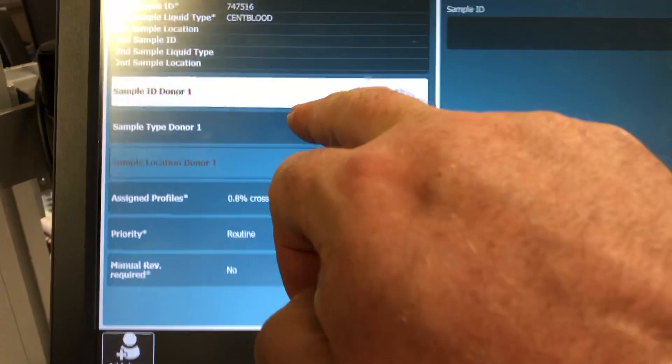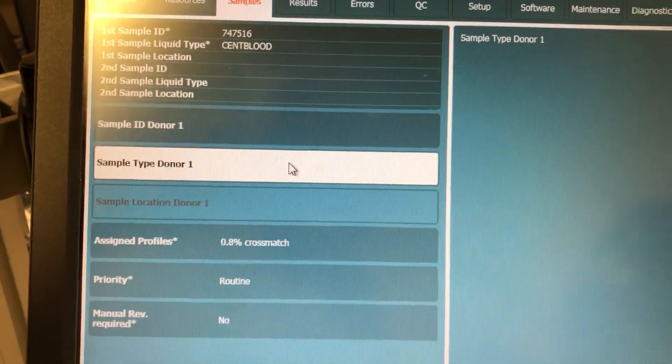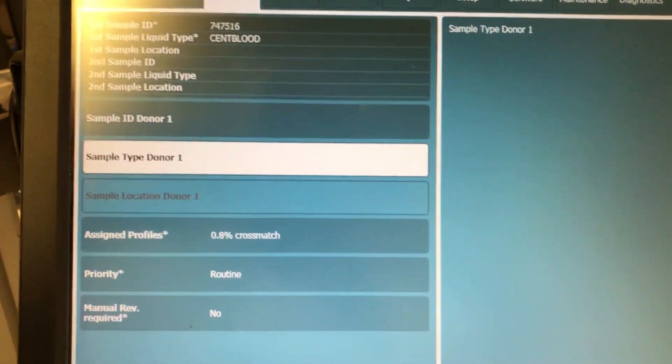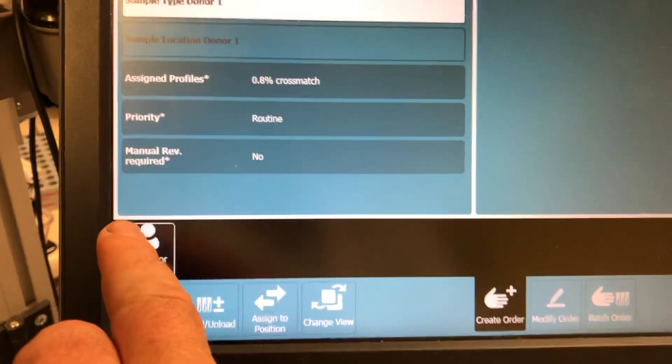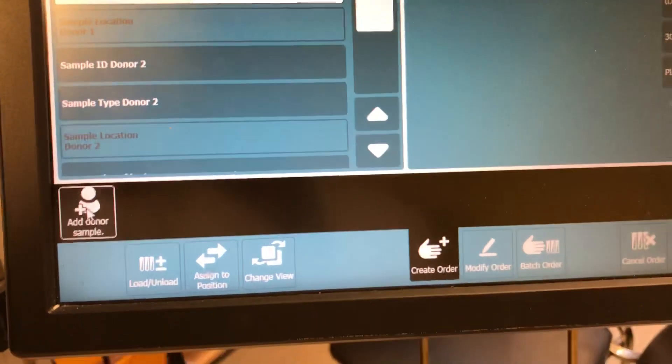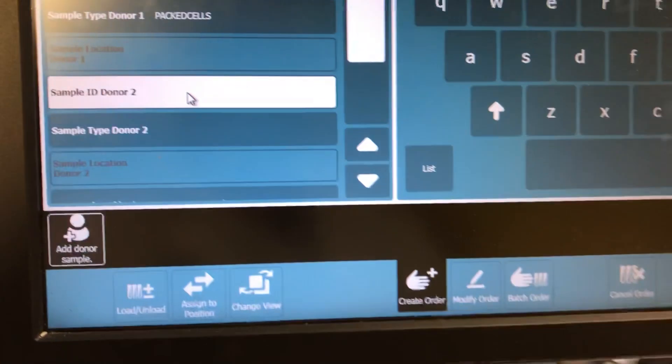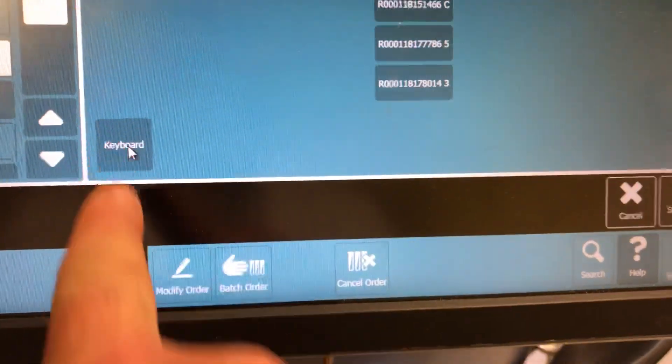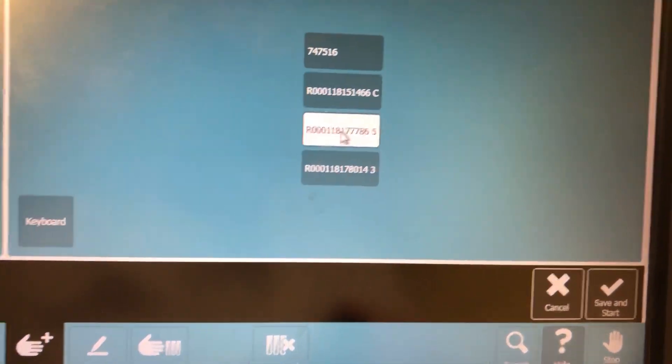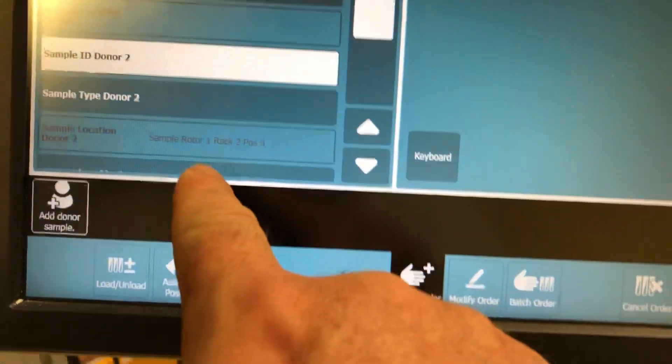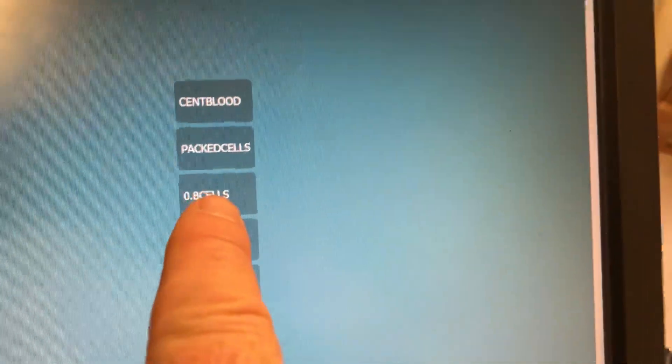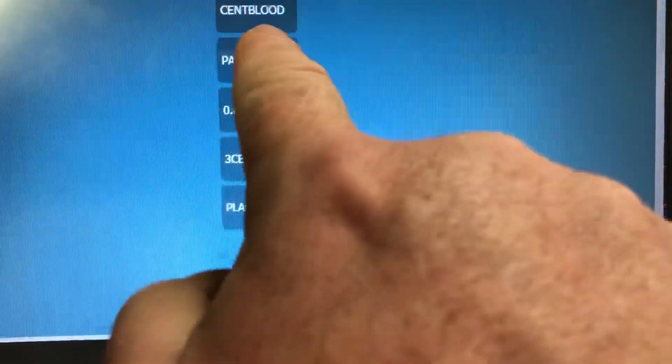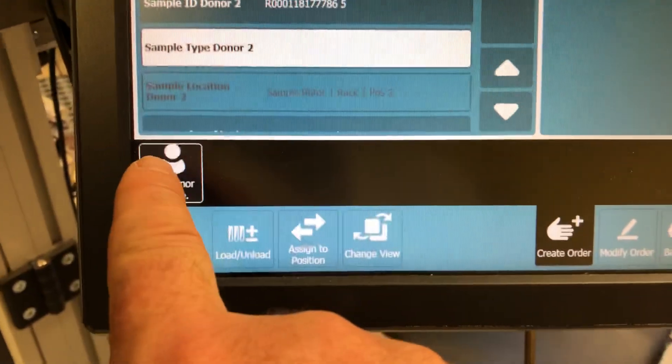So I just go into sample type, I have to tell it what sample type it is - pack cells. And then I want to add on a second donor number so I sample donor 2 and again go to list and select my second unit. Of course I have to tell it that it's pack cells. So I go back to the library of tests there and I click on pack cells for my sample type.